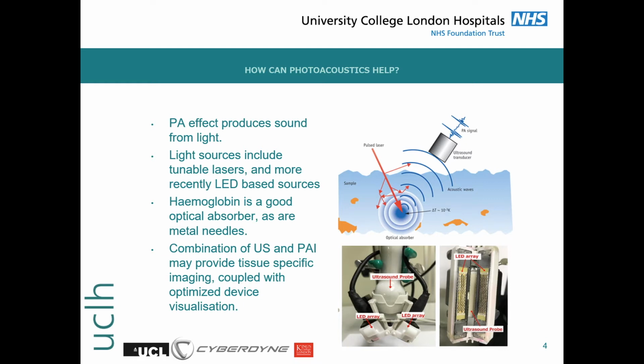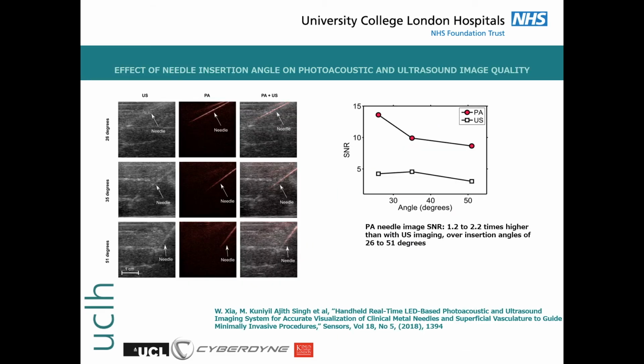One such system has been produced by Cyberdyne, and we used it to study the effects of LED-based photoacoustics on various aspects of ultrasound-guided vascular access. The transducer of the system is shown here, and you can see how the LED arrays are arranged adjacent to the ultrasound transducer. Firstly, we looked at the capability of improving the visualization of uncoated metallic needles using photoacoustic imaging.